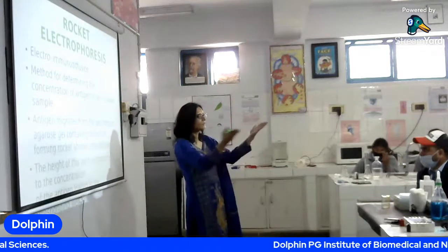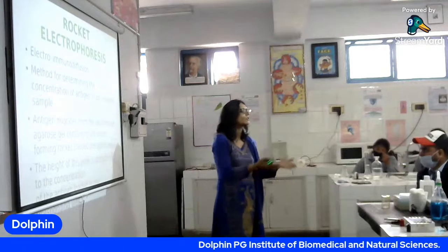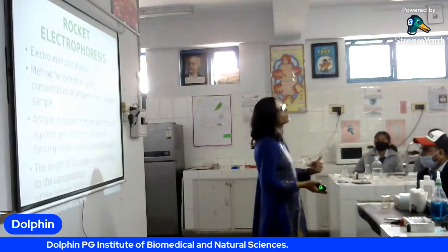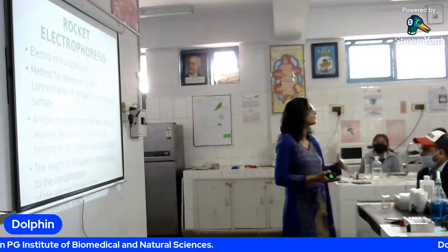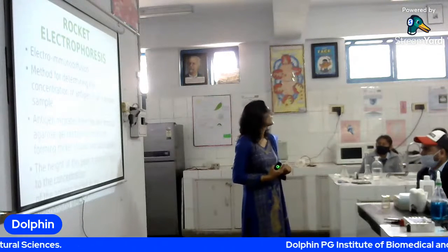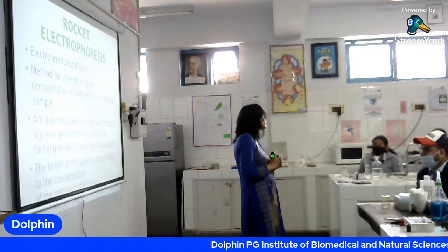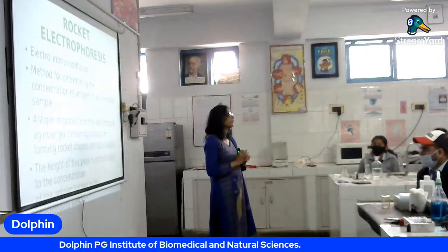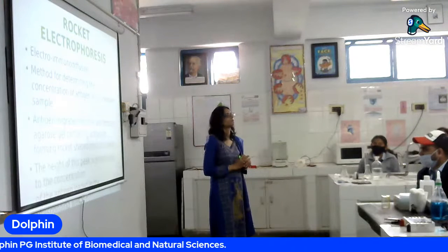Now why we are using this so much of setup? ऐसा क्यों इतना बड़ा method कर रहे हैं जब हमने simply method कर चुके हैं? Then why this method? This method is a better method in the terms of sensitivity. I hope you understand the sensitivity. Sensitivity क्या है? Can anyone tell it sensitivity?